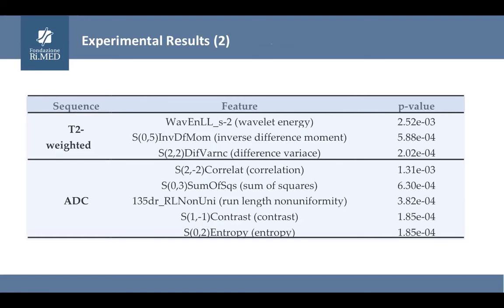Starting from a total of 46 ROIs obtained using the proposed segmentation method, and from the 290 features obtained for each ROI using Mazda software, the most discriminant texture features selected using the novel statistical method described to characterize the prostate lesion as cancer and no cancer were 3 for T2 weighted and 5 for ADC map images.